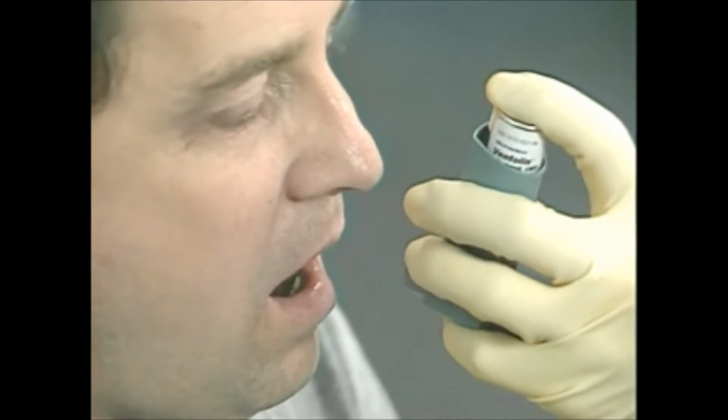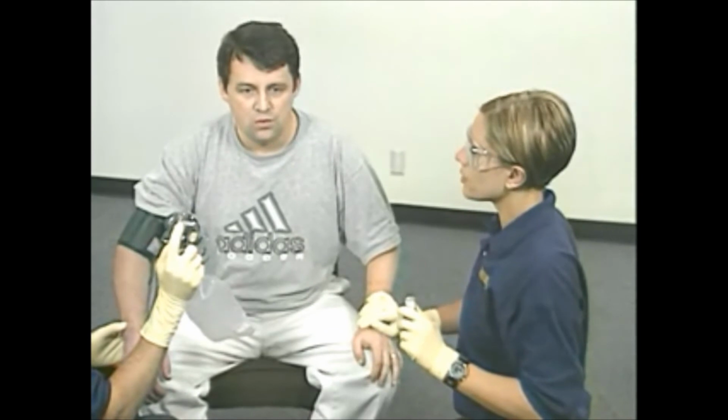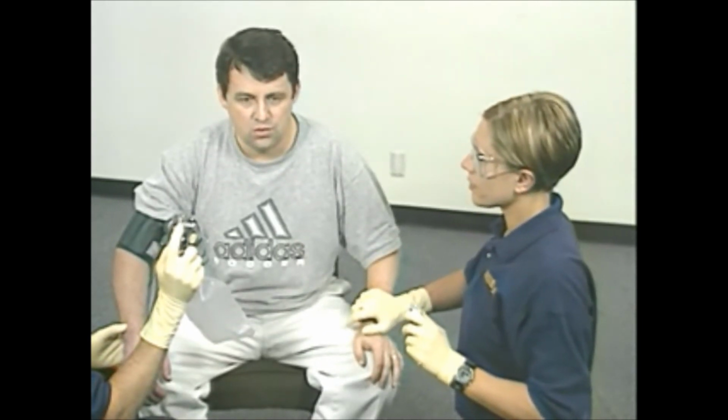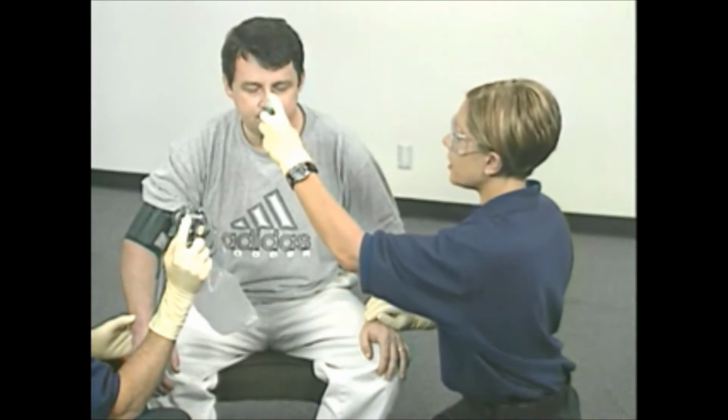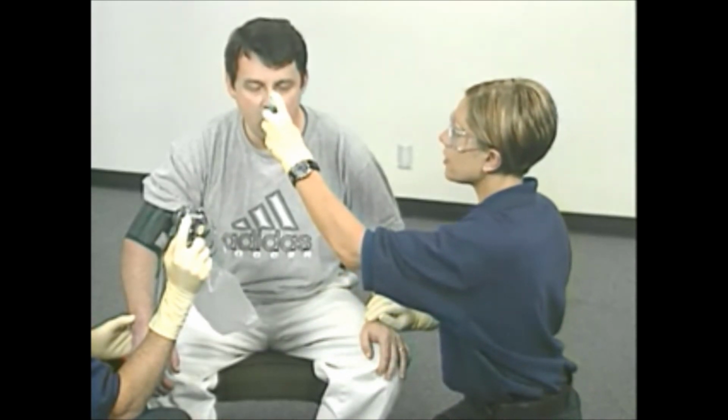Instruct the patient to hold the inhaler upright in his or her hand. If the patient cannot do so, then you should hold the inhaler. Place your thumb on the bottom of the canister and your index finger on the top. Tell the patient to take a deep breath and to exhale fully. Have the patient quickly place his or her lips around the mouthpiece, making a tight seal. Direct the patient to take a deep and slow breath over a 5-second period.